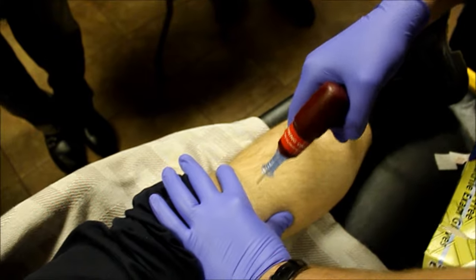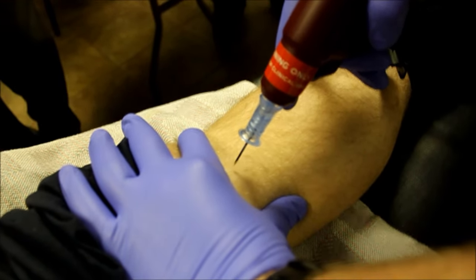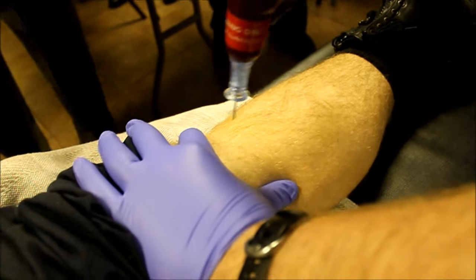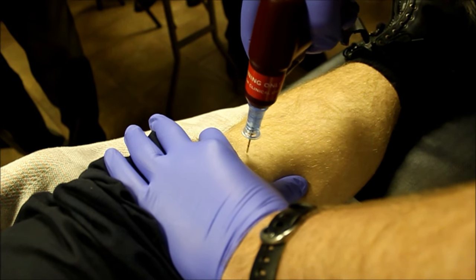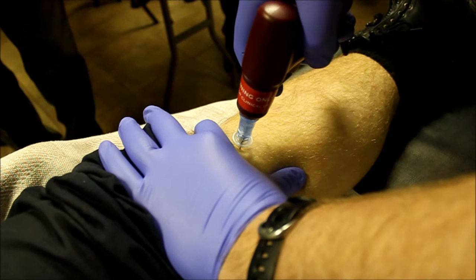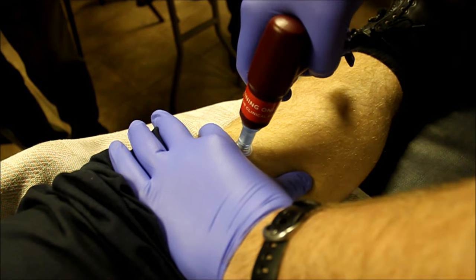You guys ready? Can you all see it? Find your landmark, go through the skin first, make sure you still see the hash mark, and make sure you're perpendicular to the bone. You're not going at an angle like an IV — you're going at a 90-degree angle. You're going to feel it poke. Go through the skin until you hit bone. You hit bone, make sure you're perpendicular, make sure you see the hash mark, and advance it. You're in.